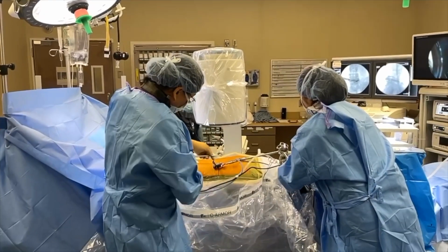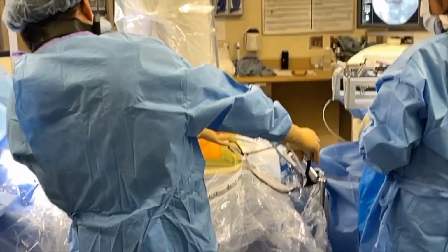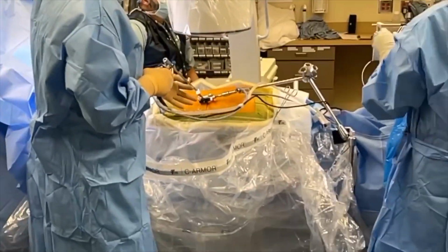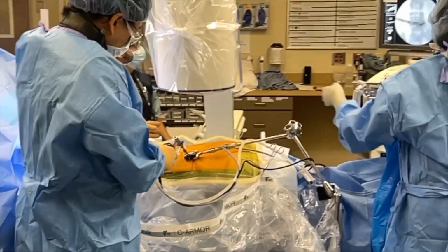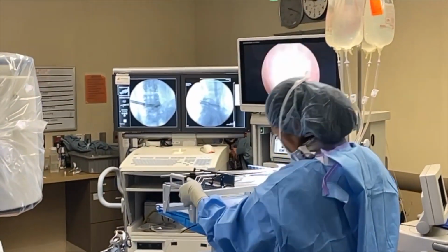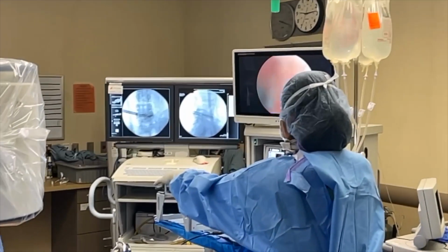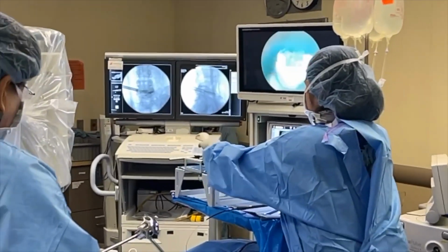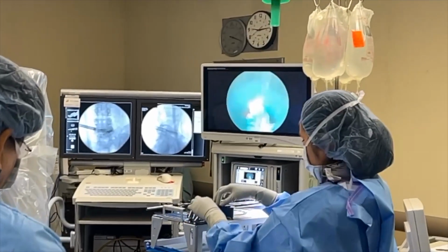So here's the endoscope. I don't know if you can see this stream right here. We call that old man pee-pee level. It's all underwater. There's a working channel. And I think doing the surgery under constant irrigation, i.e. underwater surgery, has benefits all on its own. You never let stuff accumulate. And look at this, the disc herniation is already coming out like a pimple popping maneuver.